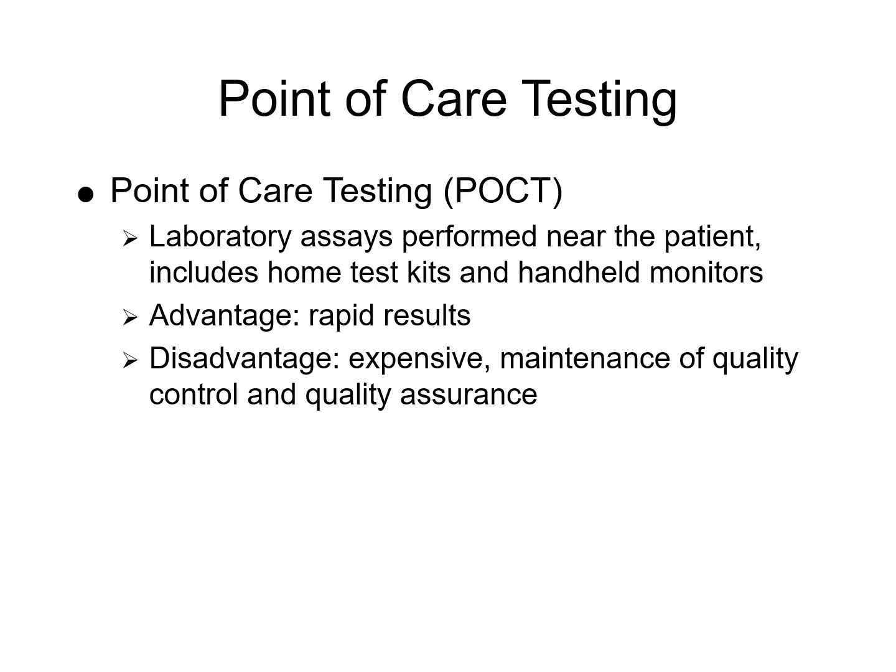So just a quick overview summary here is point of care testing allows rapid near patient testing using kits or handheld devices. Benefit would be speed and convenience, and a disadvantage would be cost and quality management. So proper training and QC practices are essential to ensure reliable results.